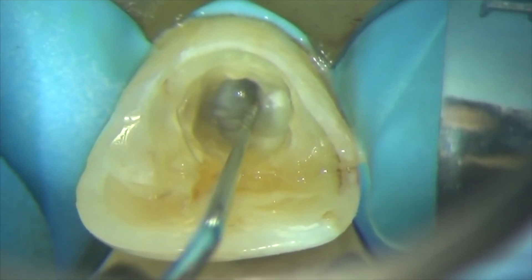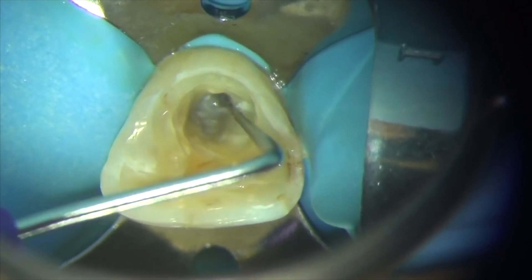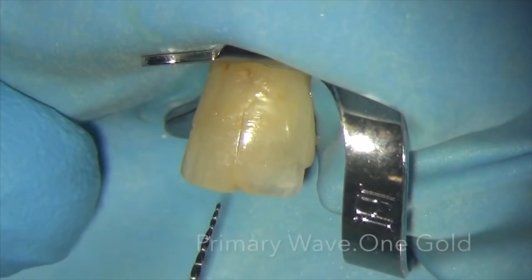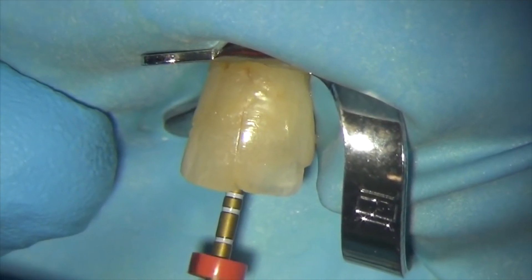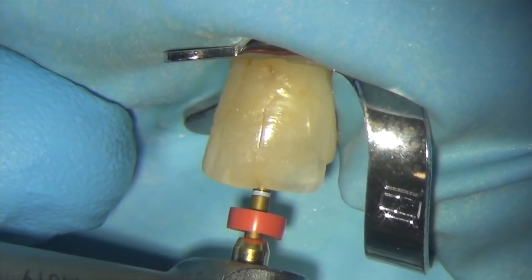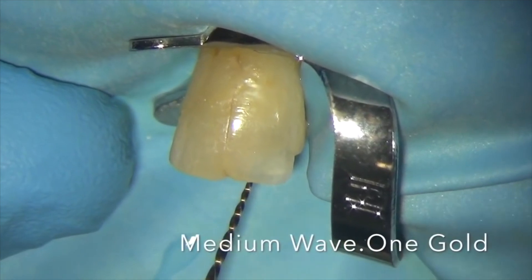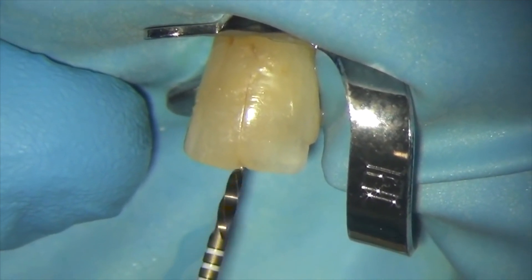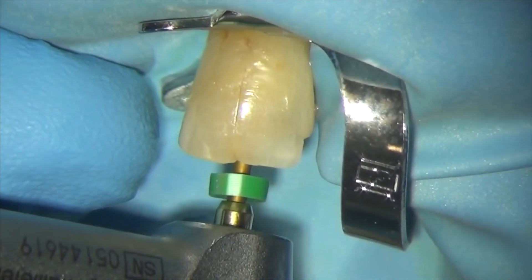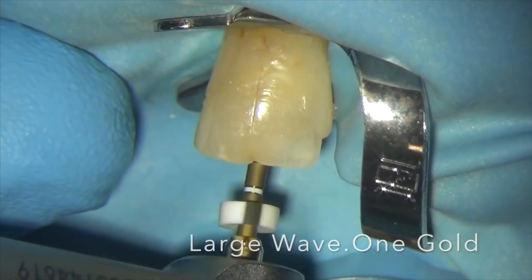Here I'm using a micro explorer to confirm that I've located the orifice of the root canal. Once I've located the orifice I can then taper this, confirm the working length, and finish prepping with the Wave One Gold instruments. Once the orifice had been located it was a simple matter of flaring, establishing the working length with an electronic apex locator, and then completing preparation with Wave One Gold files. Quite interestingly, the pre-operative radiograph looked like the canal was very sclerosed, however once I got into it it was a lot larger than anticipated and I prepped the canal up to a large Wave One Gold instrument — this is not an uncommon finding and sometimes you can be pleasantly surprised.